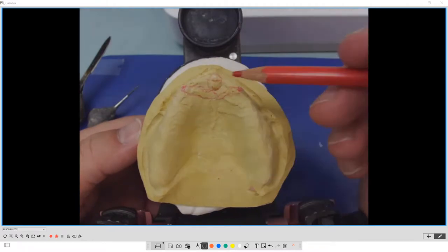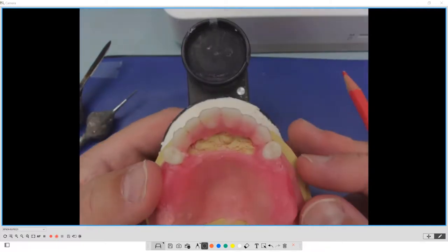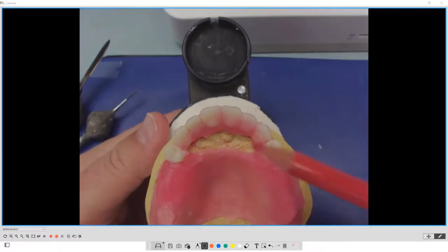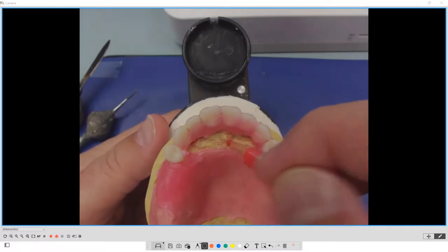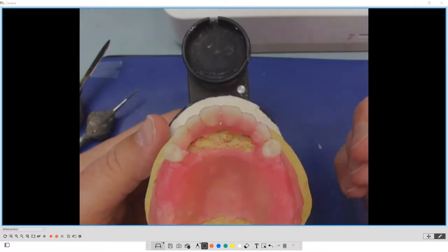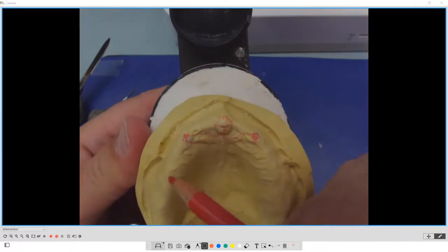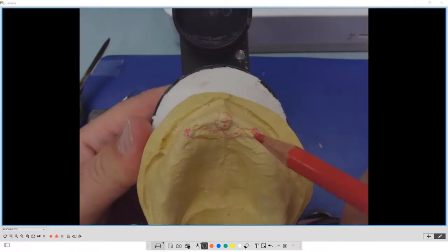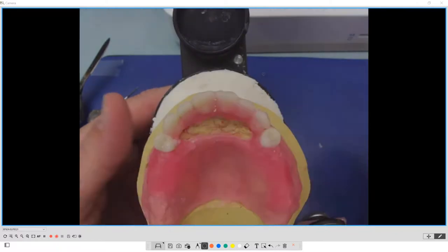And it's a little bit more detailed than what we've been doing conventionally. So this shows us now that I'm on target for where I am. Now you can notice that I'm here, but on this patient, the midline is here. So I'm skewed off the surgical midline for this person. And that's on purpose, because actually this case isn't symmetrical. And so now I need to push the midline over for this patient in particular.